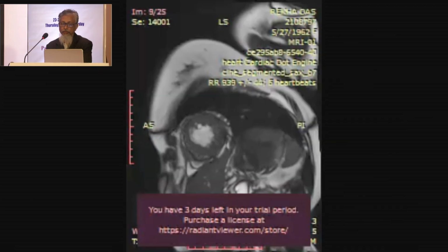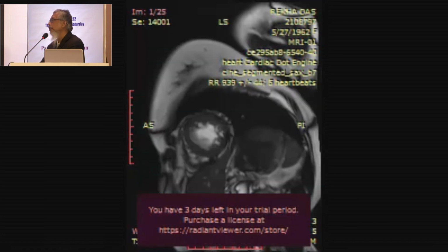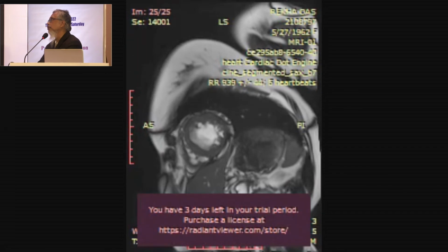So for this patient, we thought that in some cases when we find akinesia in the dobutamine stress echo, the final frontier is MRI, or the other frontier could be positron emission tomography. So we had MRI facilities in one of the private diagnostic centers where one of our colleagues works. You can see in this MRI image that there was some motion in the LAD territory.